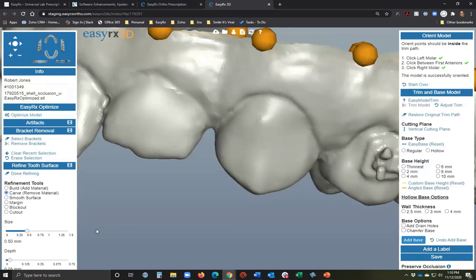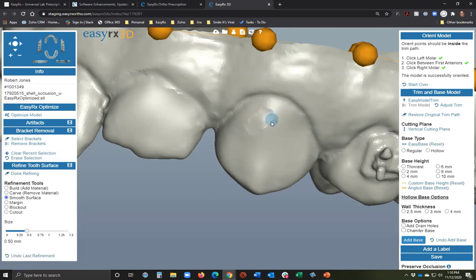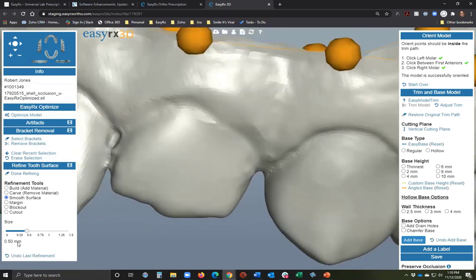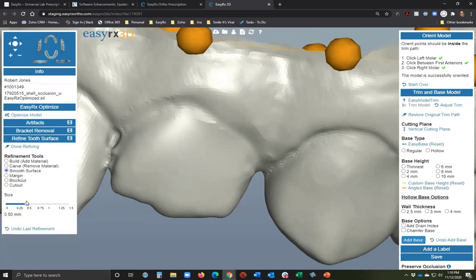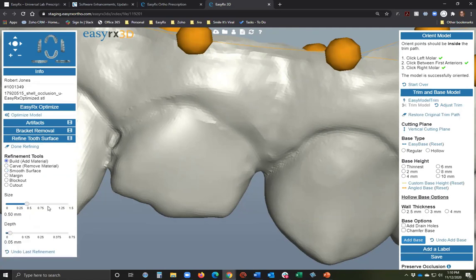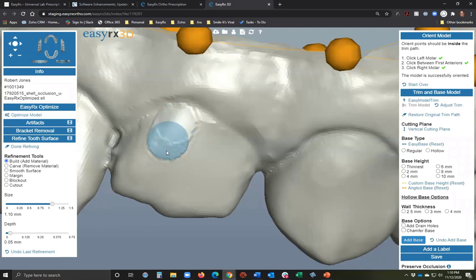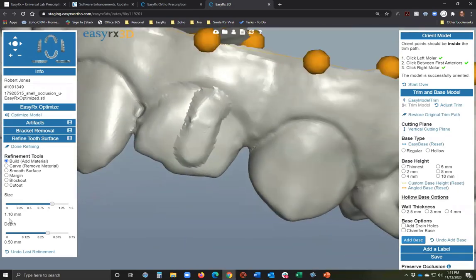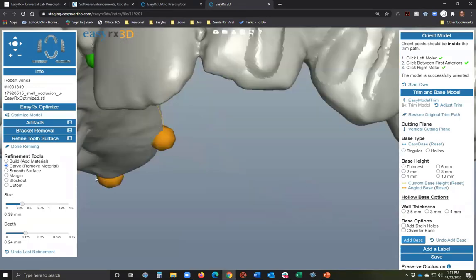If you accidentally touch the bracket pad, you'll see a remnant. Use 'Carve' then 'Smooth' to clean it up. The 'Build' tool adds material — you can adjust size and depth sliders. The same size and depth controls apply to smooth, margin, block out, and cut out. We have default settings but you can adjust the sliders to make the brush size and depth bigger. For a clean removal, draw the margin with shift, then smooth.